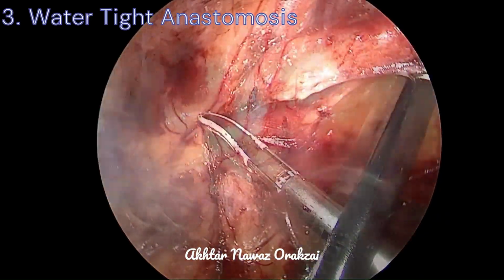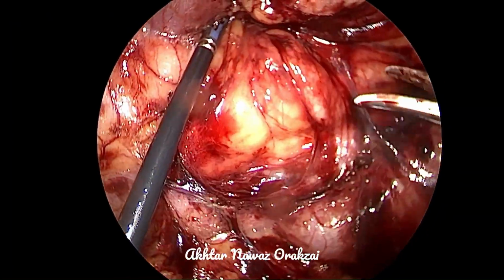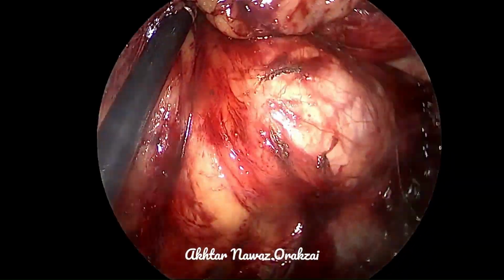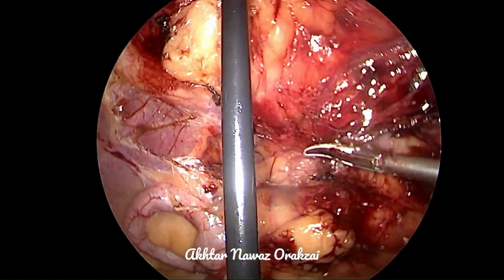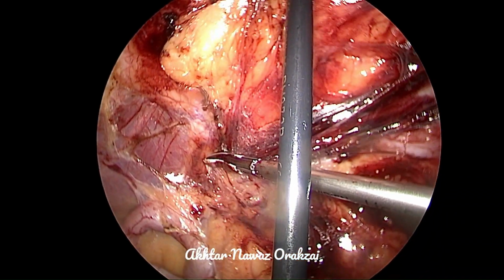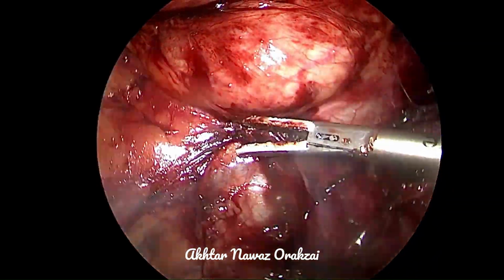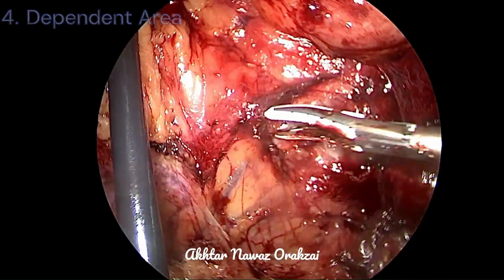Then the anastomosis must be watertight, because any leak of urine from the anastomotic site would lead to inflammation, and this inflammation will incite more inflammation, and by the end it will heal by fibrosis, and thus the PUJ will be stuck in fibrosis once again. So the reconstruction may fail, be it a continuous or interrupted suture, but it has to be watertight.